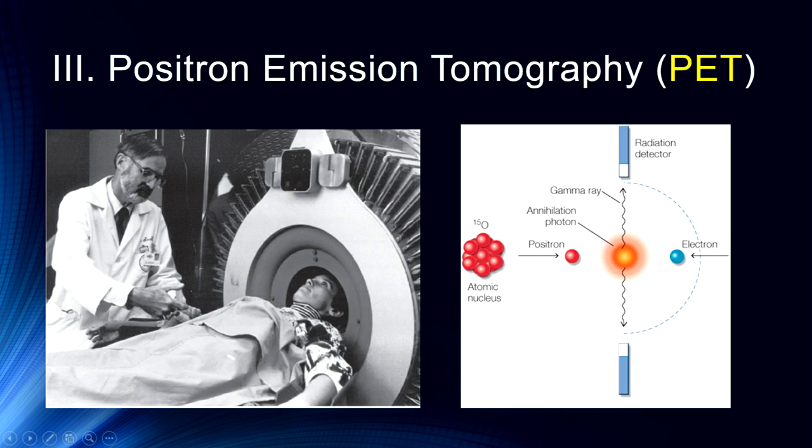One of the things, and we'll talk about this in a moment, that is a problem with this particular technique is those radioligands generally have to be manufactured on the premises or very nearby because they rapidly decay, and so you couldn't order it from Amazon and have it arrive a week later, because there would not be enough of the radioactive ligand left.